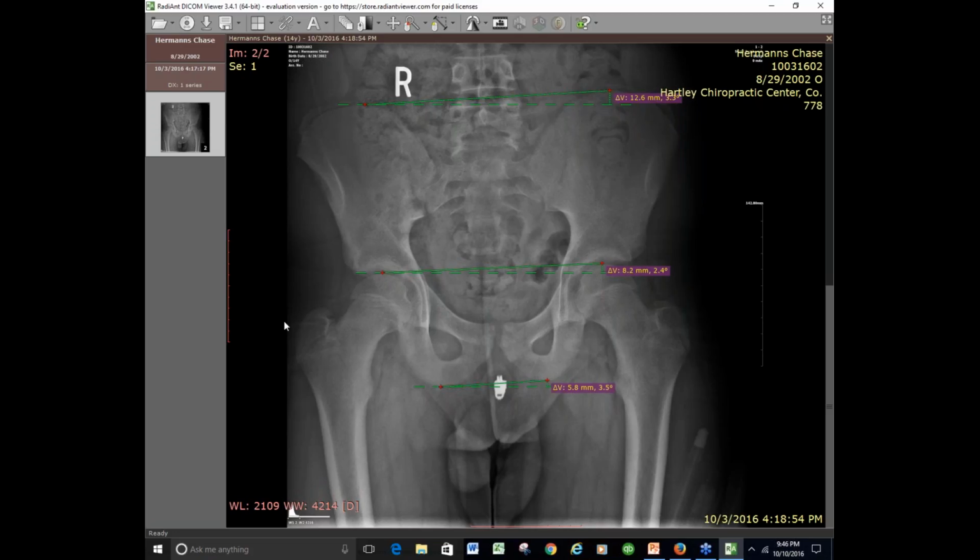That's really going down to, you know, listen to Travell. She knows what she's talking about. Check those pieces, and trust your eyes, right? Trust a little bit of your measurement. If you put them in that lift and, man, they look too high, but that's what the x-ray says, double check the x-ray.